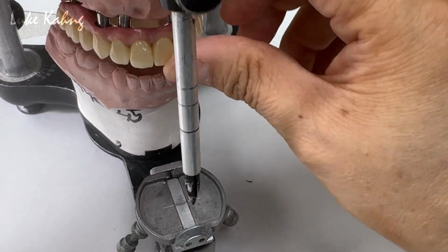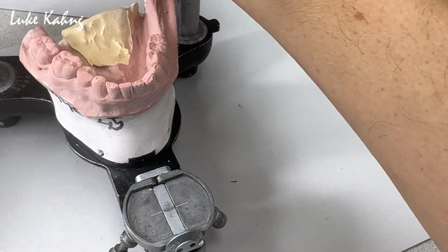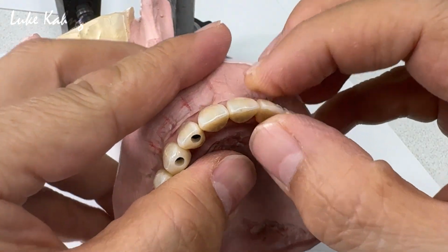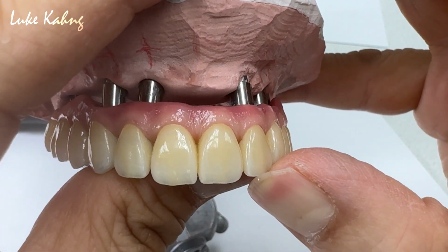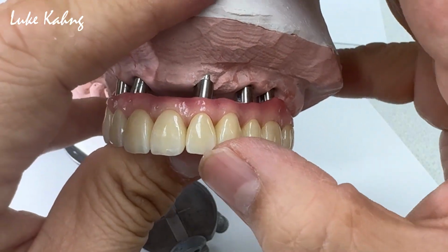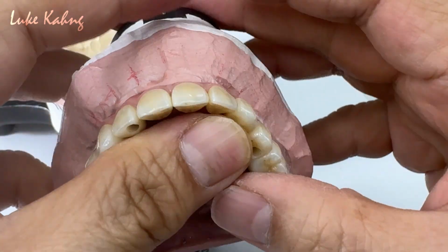Great full mouth Titan 7-star case. The only thing is doctor has to do a little bit tricky. They have to do a little bit of push here so they can get the same line angle. Okay. This is another beautiful one. And compared to before, the patient's information we changed quite a bit.